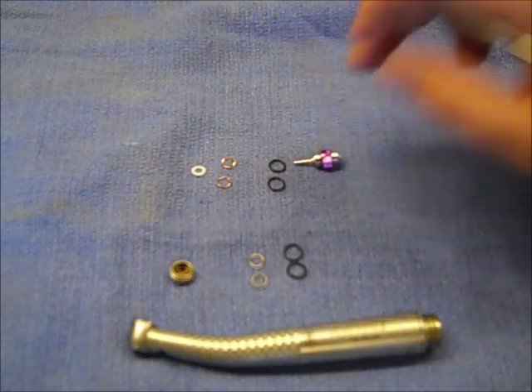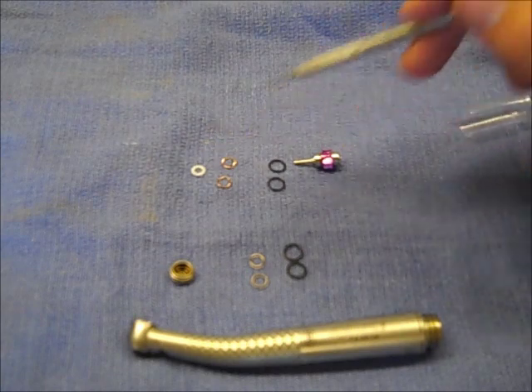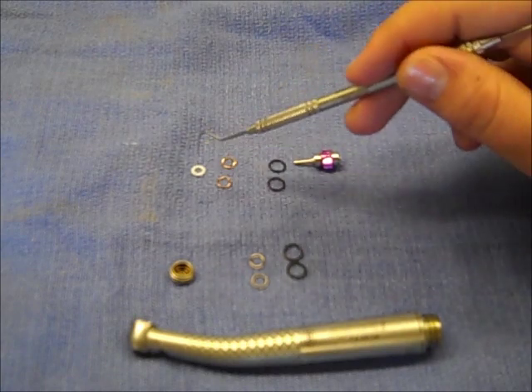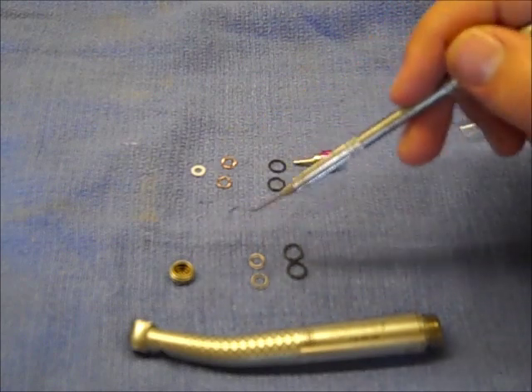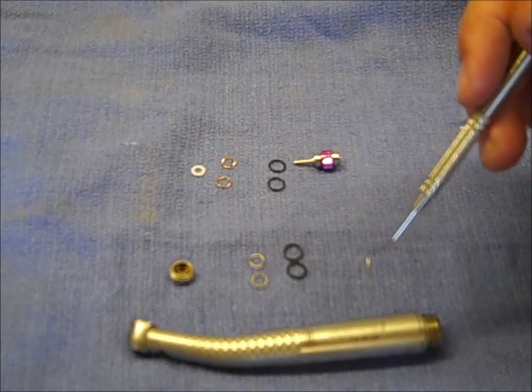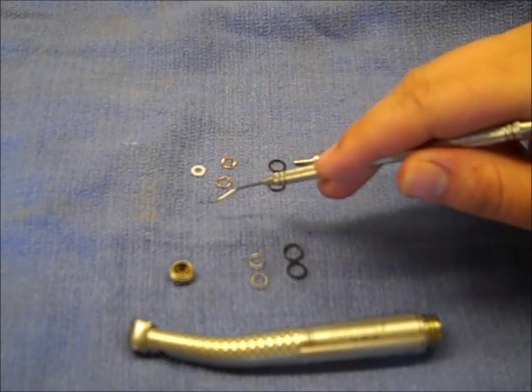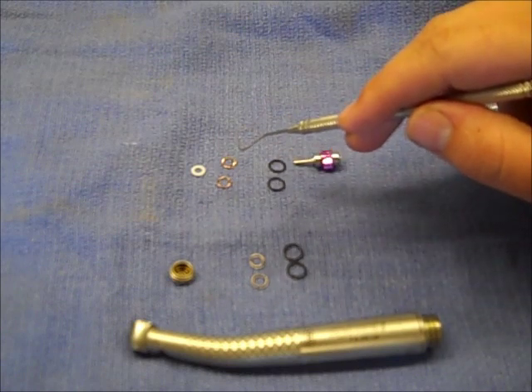This is what you get from us: you get a new turbine, two O-rings, two brass washers, and a white Teflon washer. These brass washers and the Teflon washer we only recommend using if yours are no good. W&H is kind of varied on what they put in there, so we send these along in case you lose one or if one is broken. Otherwise you don't need to worry about using those.